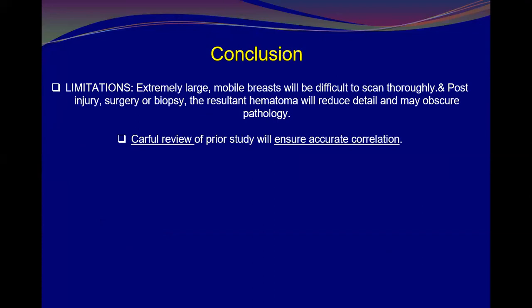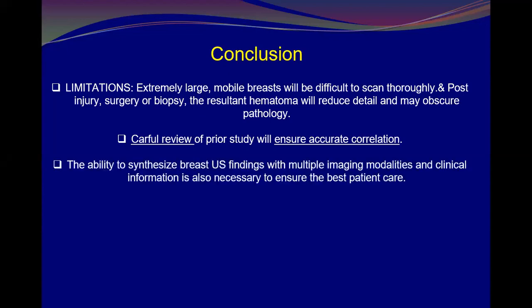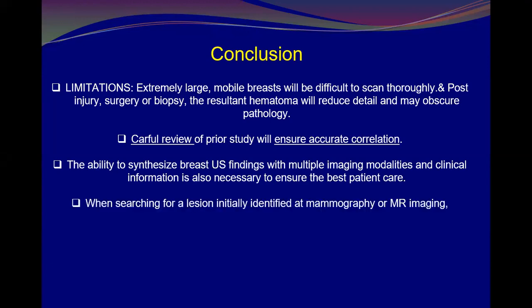So it's important to have a careful review of prior ultrasound studies to ensure accurate correlation, and the ability to synthesize breast ultrasound findings with multiple imaging modalities and clinical information is also necessary to ensure good breast patient care.